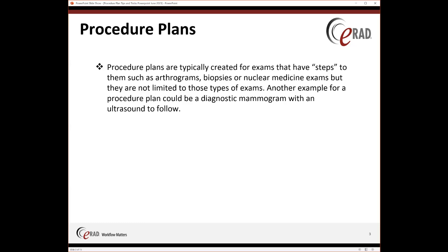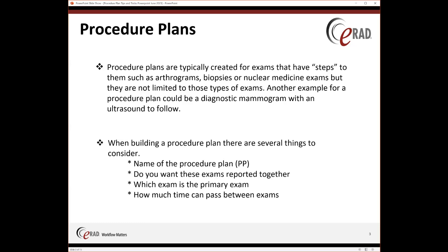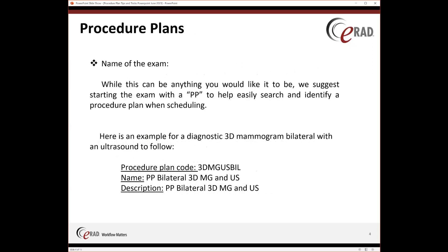When building a procedure plan, there are multiple things to consider: basically what you want to name it, do you want these exams reported together, which exam is going to be your primary exam, and how much time do you want between these exams — which can be pretty important if you are using contrast. For naming, it can be anything you would like, but we highly suggest using a 'PP,' which stands for procedure plan, in front of the name. This helps your schedulers easily identify that it's a procedure plan.